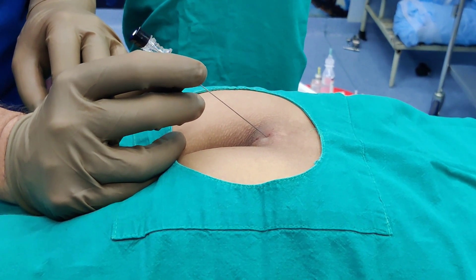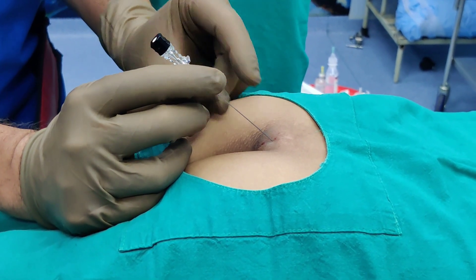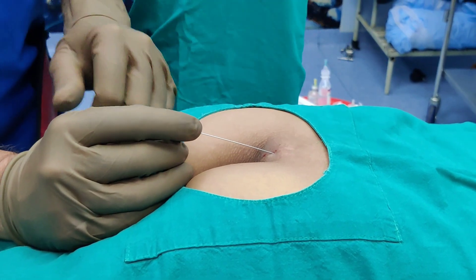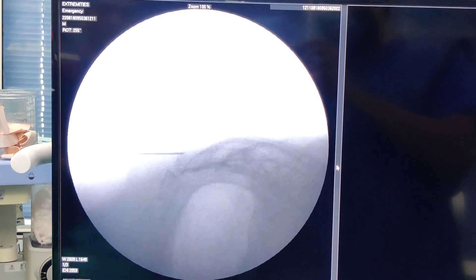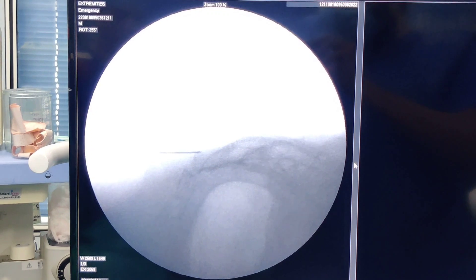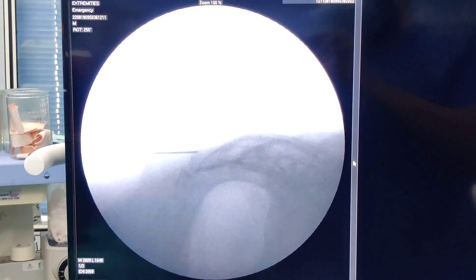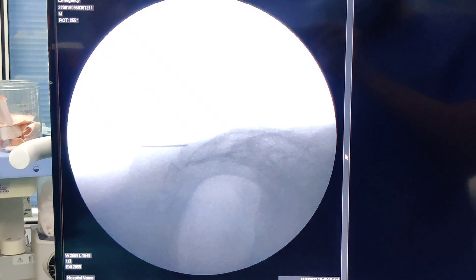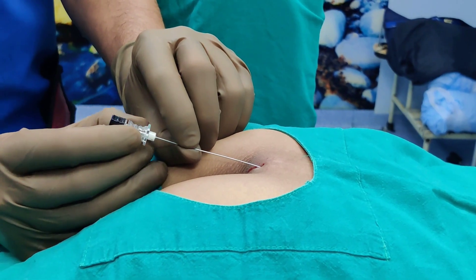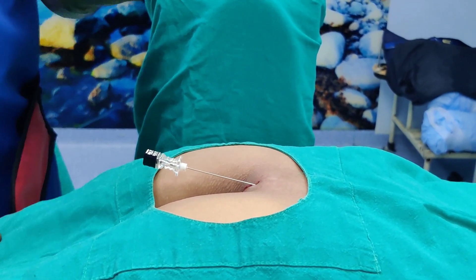Once you have localized your area, the initial needle insertion will be at 45 degrees. You enter at 45 degrees, check the position under the C-arm, and if you are in the right spot you slowly lower the needle and pass it into the canal. My entry point is good — I am just on the tip of the cornua. I gradually reduce the angle from 45 degrees, making the needle more horizontal as I advance it into the canal, and it appears to be in the right spot.